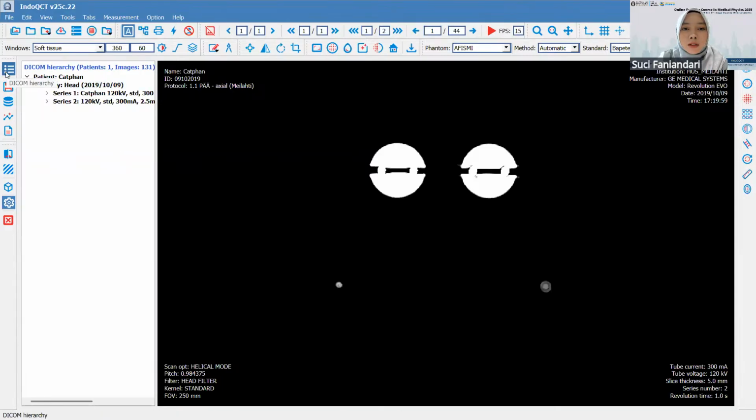Okay, and then we can continue to the second question from Miss Afrah Al-Sadi. What is the reason if it is empty, even if I choose all and click search? Okay, the reason for the empty field is because your local server is also empty.